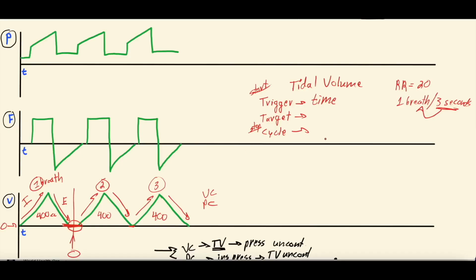So what then causes the ventilator to stop a breath is the tidal volume, and what the ventilator targets is the flow. And this is where things get confusing, but if you understand this, you'll understand the scalars, or possibly vice versa. So let's pause. I told you in volume control, you're setting a tidal volume for the ventilator to give with each breath, right? But I just then told you that the ventilator's targeting a flow. Well, what's that about? Why wouldn't it target a tidal volume, right? If I said, give it a certain tidal volume, why wouldn't it just target the tidal volume?